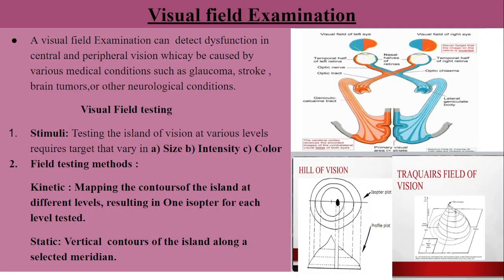Visual field examination. A visual field examination is a diagnostic test that measures the extent and sensitivity of a person's visual field, which includes both central and peripheral vision.